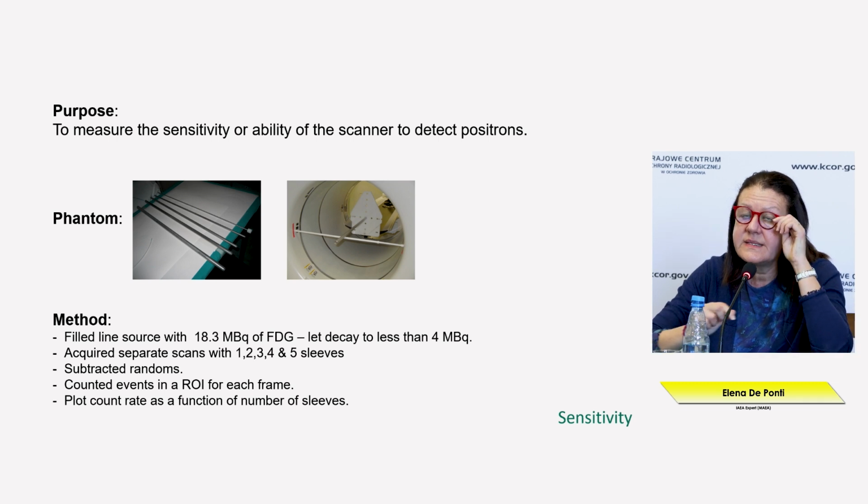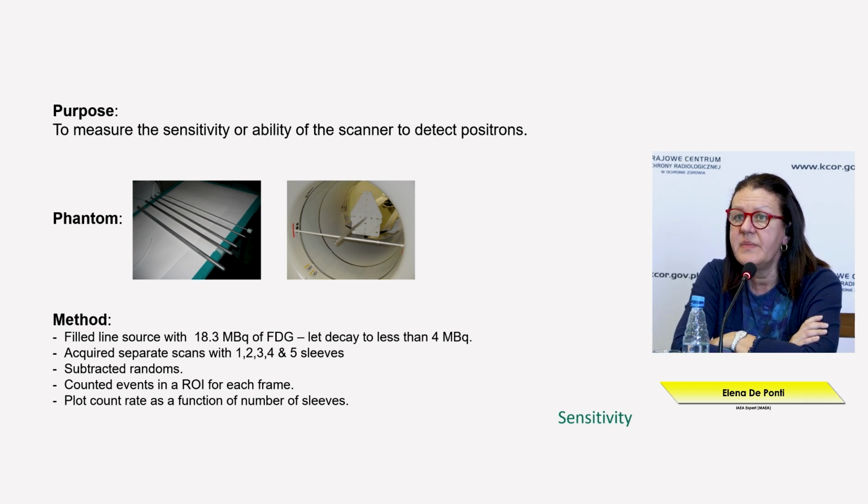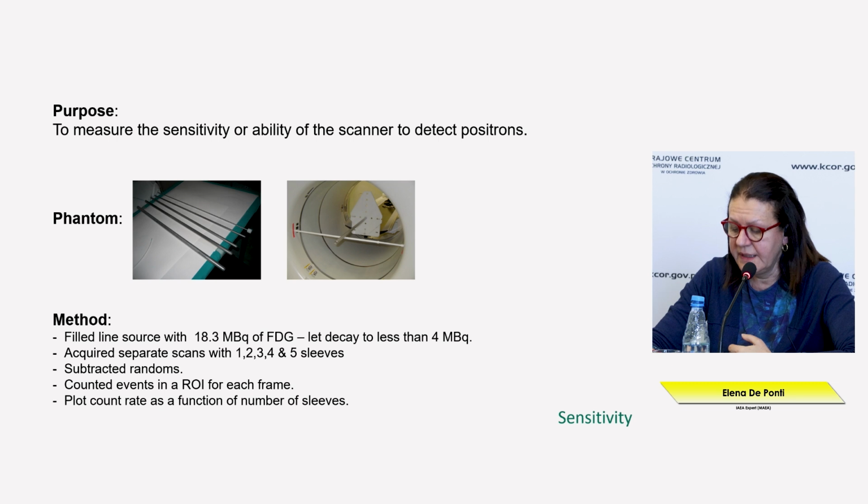This is another example, for the sensitivity measure. Also in this case, the very particular phantom is well described, and we have some suggestions on how to perform the setting with this kind of phantom, and detailed information is provided for the amount of activity that we need for the sensitivity.